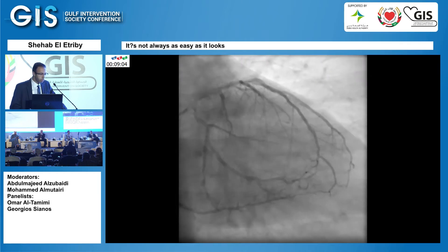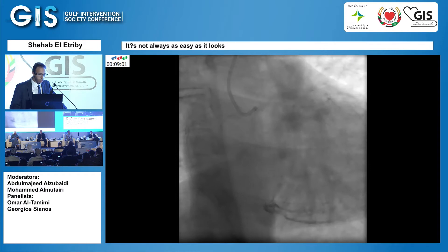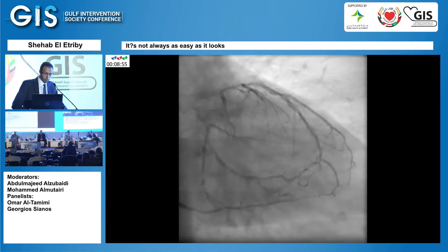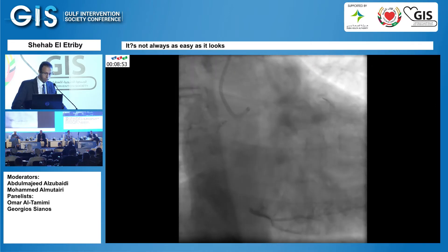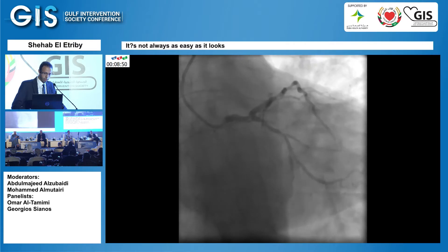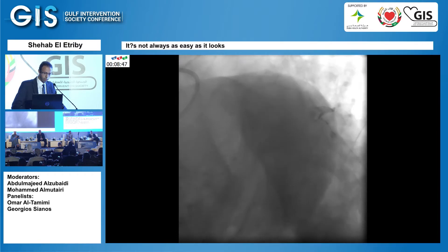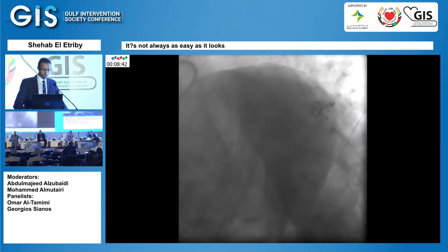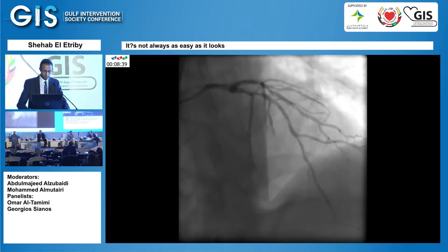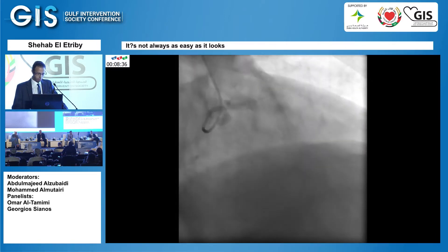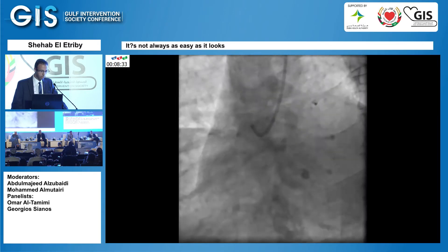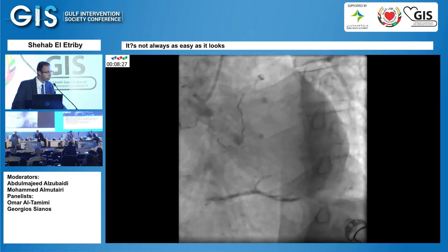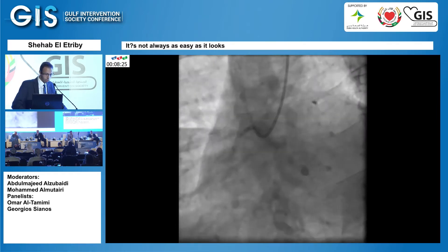This was his left system via the right radial approach. There is significant left main disease and LAD, and a CTO of the RCA filling retrogradely from the LAD — you can see a huge RCA. This is the spider view showing a difficult angle to the LAD, and this is the RCA with a calcific proximal lesion and probable bridging collaterals in the distal part.